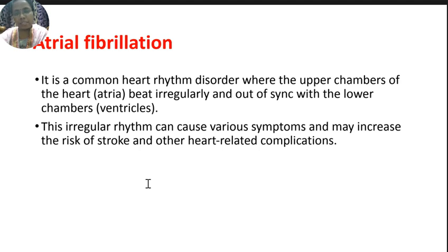These are some other diagnostic tools available to diagnose heart-related disorders. But anyway, ECG is a very preliminary and friendly method, and we can easily acquire the ECG signal within a very short duration of time. If any patient has basic symptoms or chest pain, the first and foremost step we can take is the ECG. With the help of abnormal and normal ECG waveforms, we can diagnose a number of disorders.